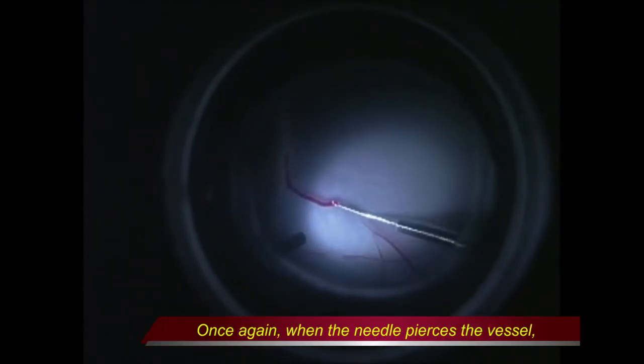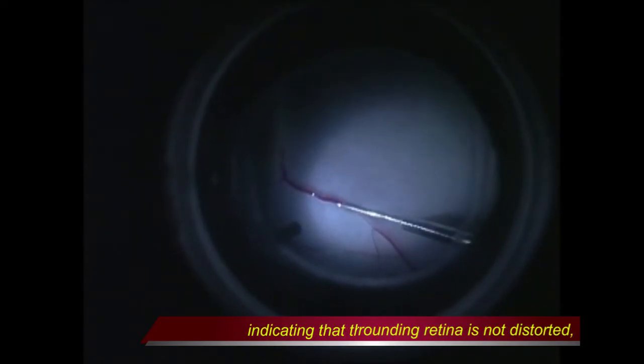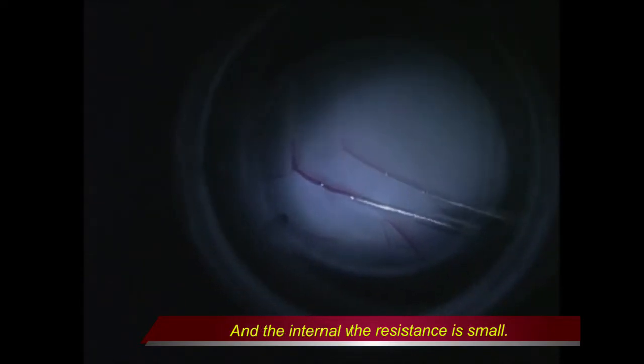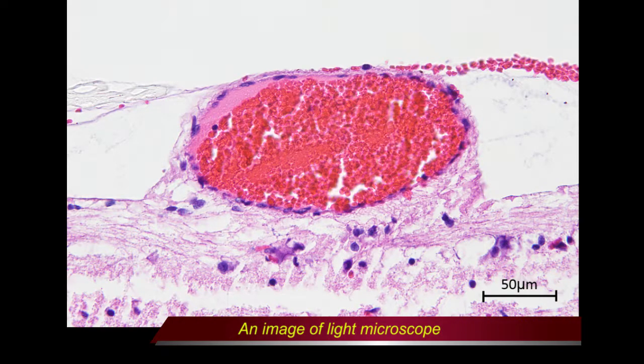Once again, when the needle pierces the vein, the vessel including the surrounding retina is not distorted, indicating that the resistance is small. The internal wire advances smoothly and seems not to damage the vessel. The image taken by light microscope shows that the endothelial layer of the retinal vessel was not damaged.